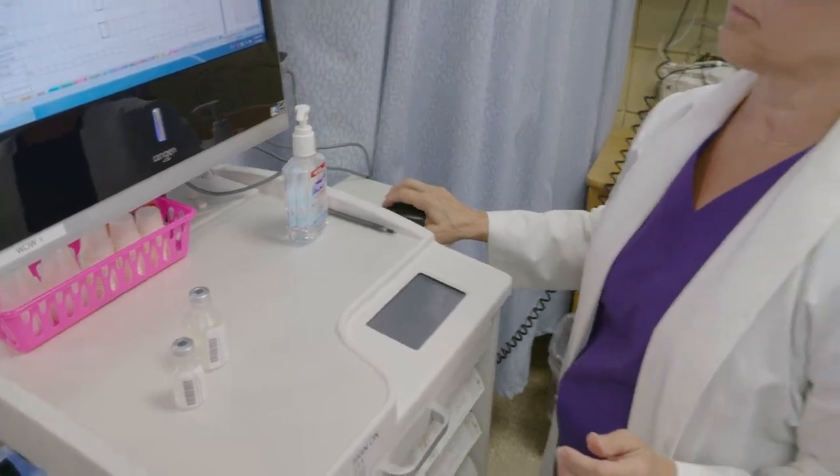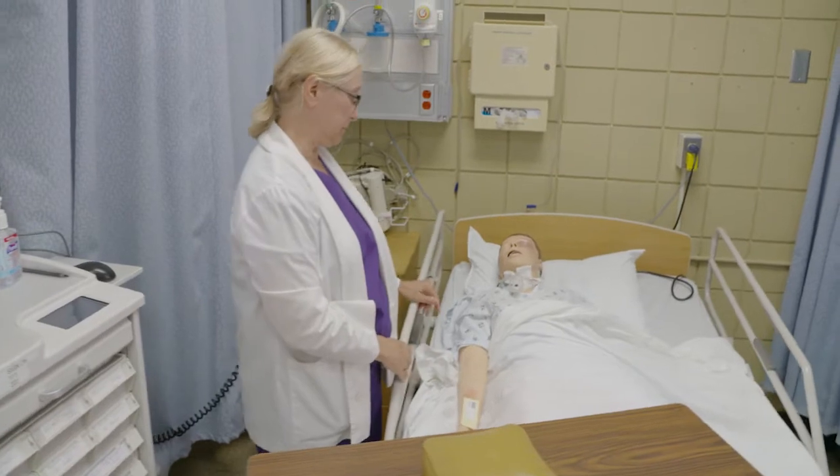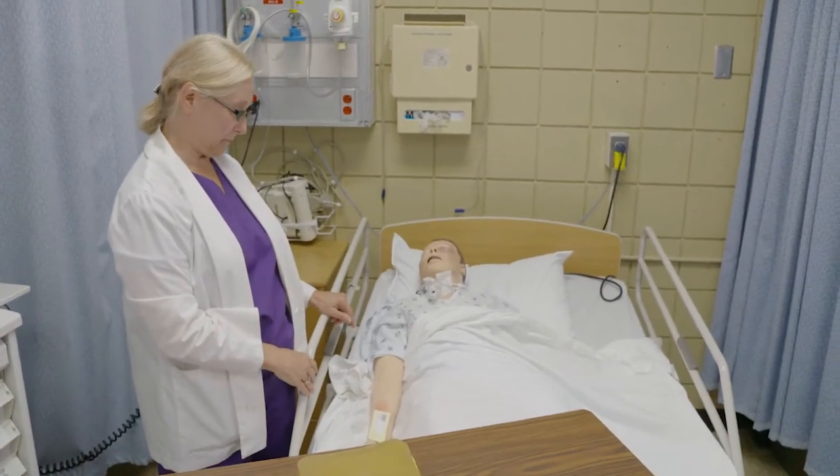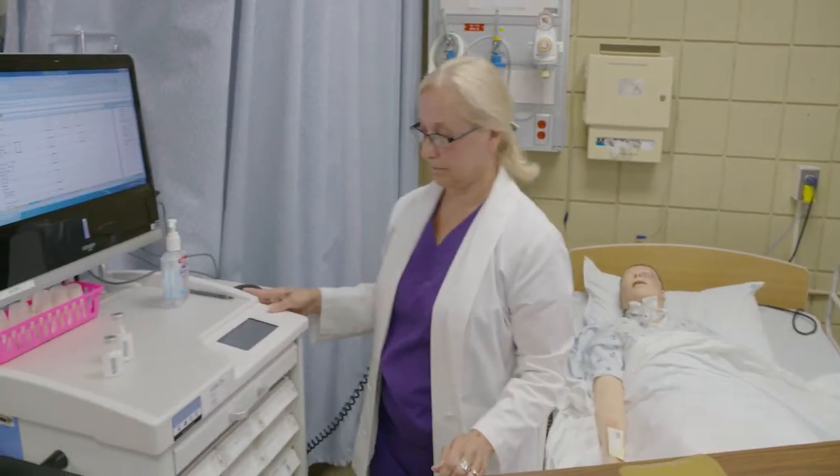Explain to the patient that they have their Procrit injection. You may ask them where they would like the injection or where they had it the previous time. This patient would prefer the injection in the abdomen.